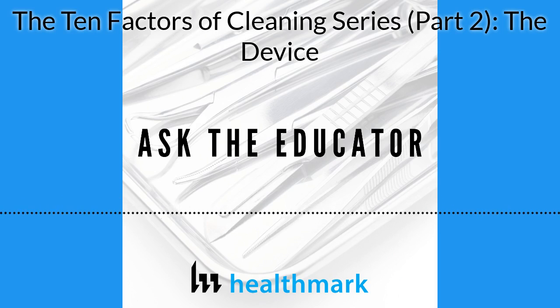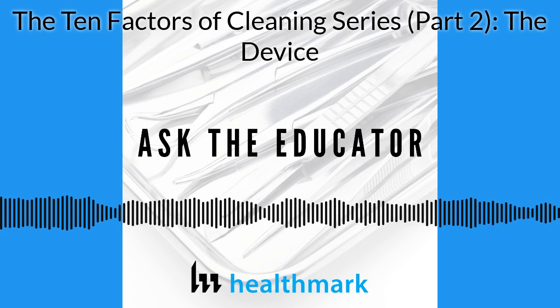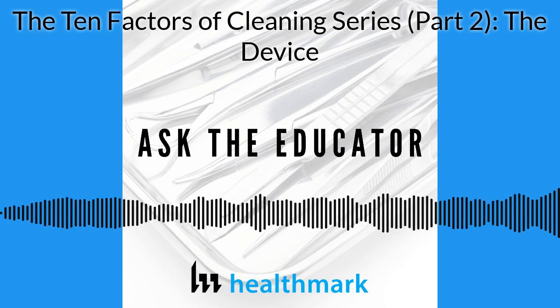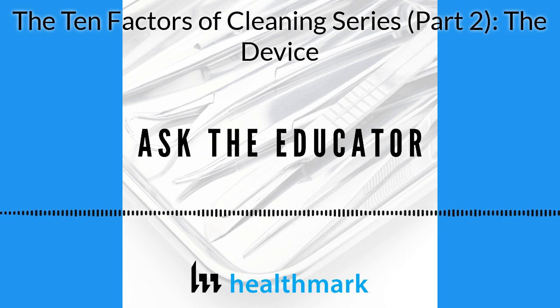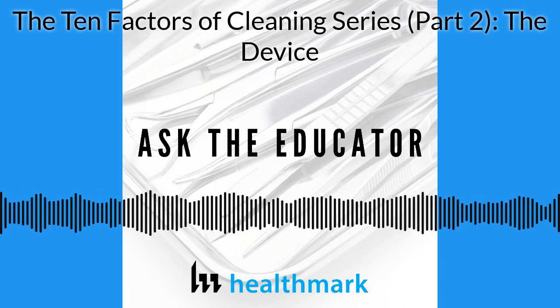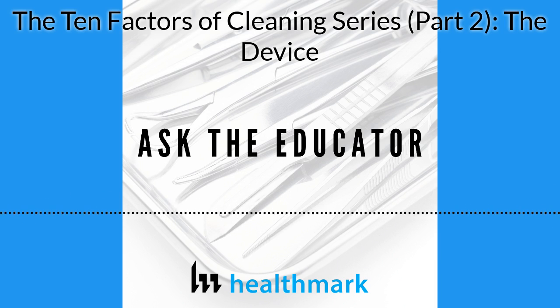I think of the new laparoscopic instruments that come apart into 2 or 3 pieces, or the cutting jigs inside of a total knee tray that come together and that we have to remember to take apart afterwards. All of those things. We even had a simple screwdriver. It was a cannulated screwdriver for a spine set. Looked like just a regular screwdriver, but it takes apart, and it's one of those things you have to be cognizant of in order to adequately process it.